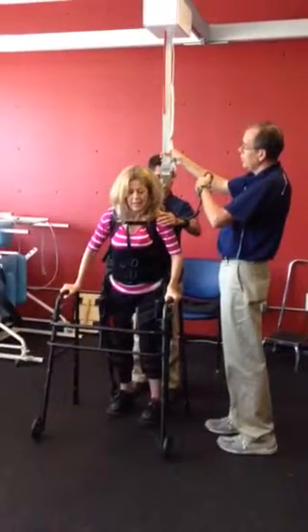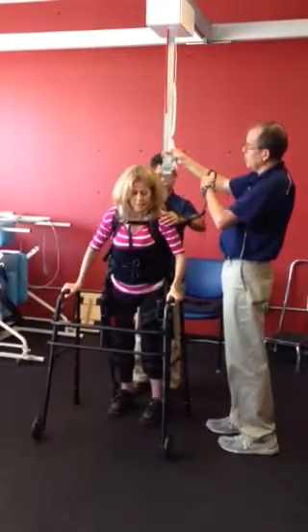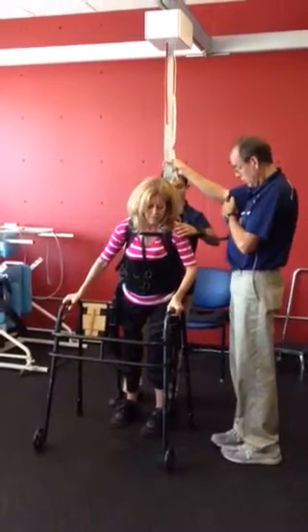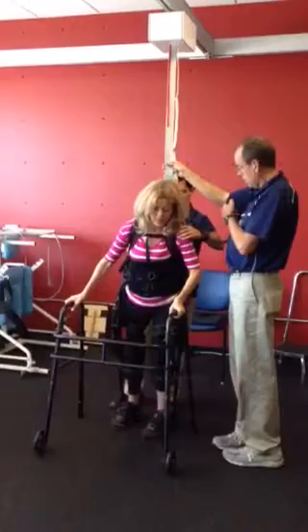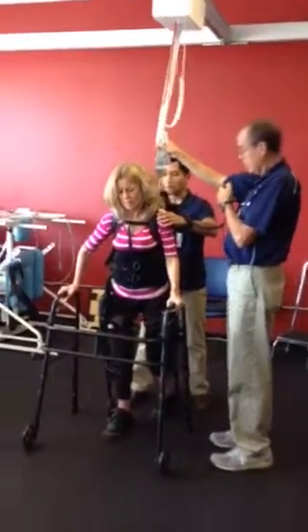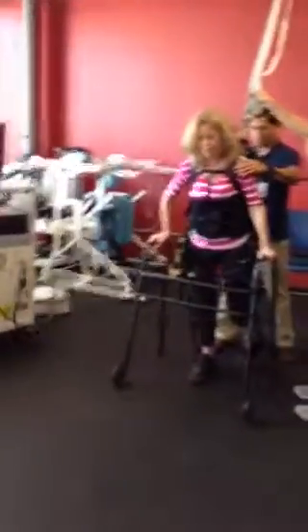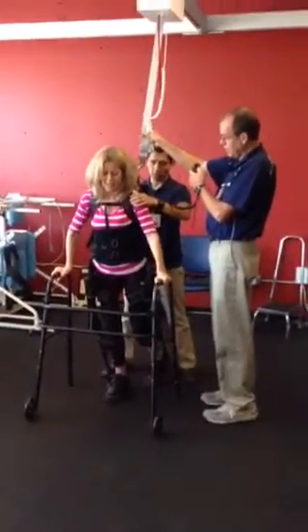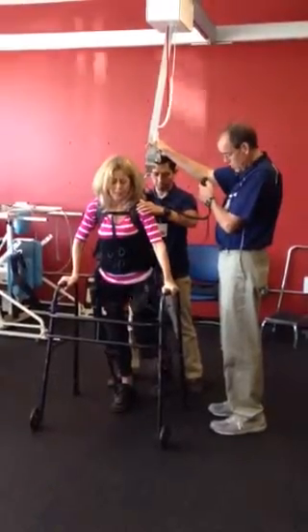So do I lean which way? Now we lean left. A little more. Right there. Just left, not forward. And step. Good. Walker. Put your weight over that right leg. I'm scared — I can't do this. You want to have one more? Yeah. And step. Good.